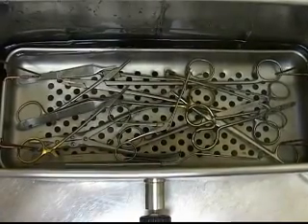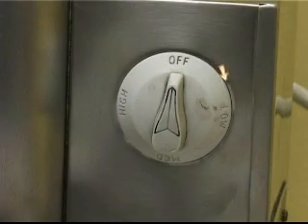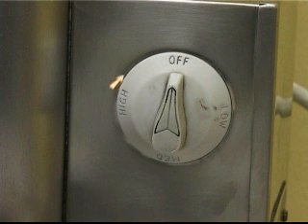If the water does not get hot: first check if the sterilizer is plugged into the wall socket, check if the wall socket is switched on, check if the water boiler is switched on, and check the thermostat and turn to the appropriate setting.